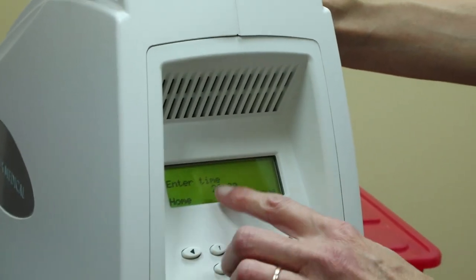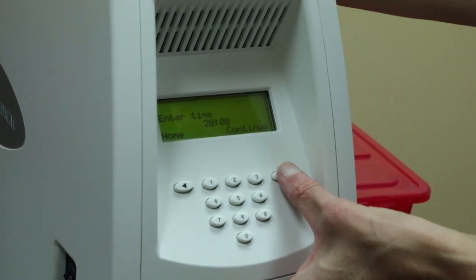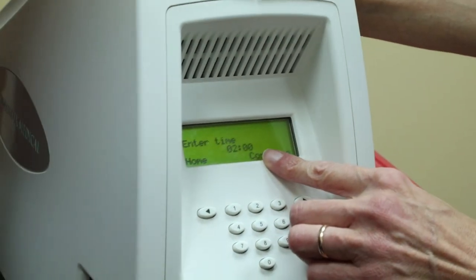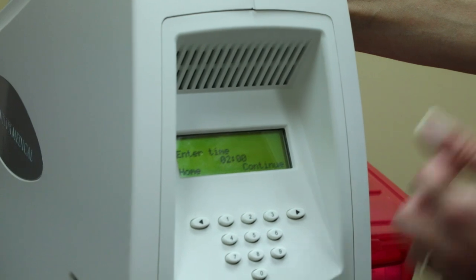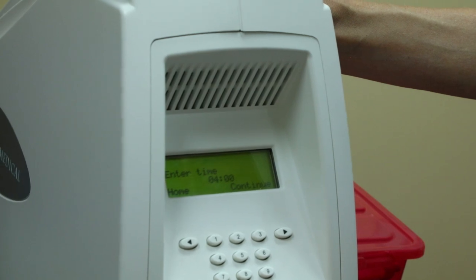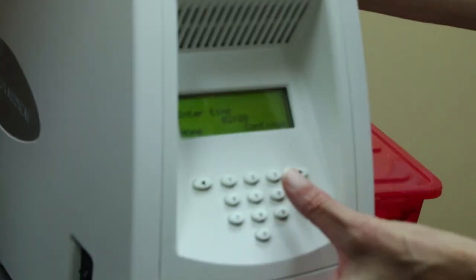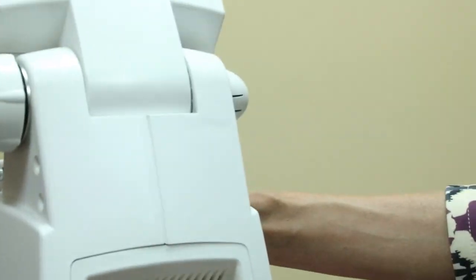We want time and we don't want 20 minutes so we can reduce that. You can either start it and let 20 minutes pass, or you can type in the time by overwriting it — for example, type 0-2-0-0 to do two minutes, or 0-4-0-0 to get four minutes. Whatever the protocol says is where you would want to go. Hit continue and then confirm the time. Now the light has activated but it's still not starting yet.